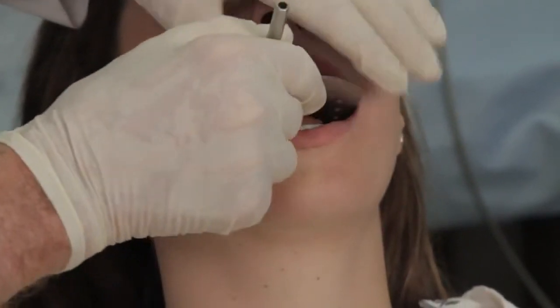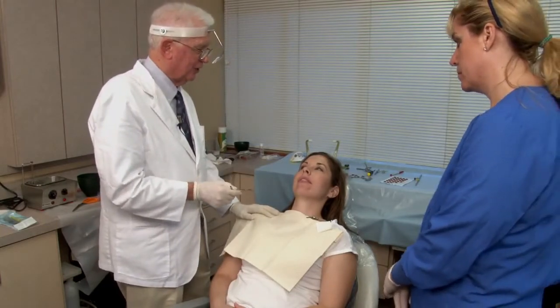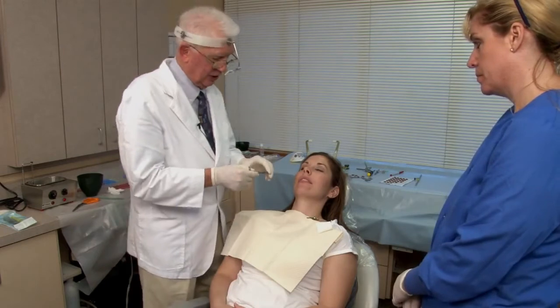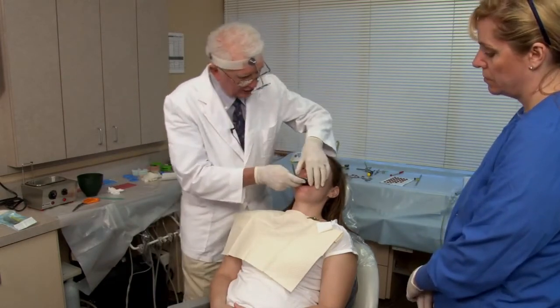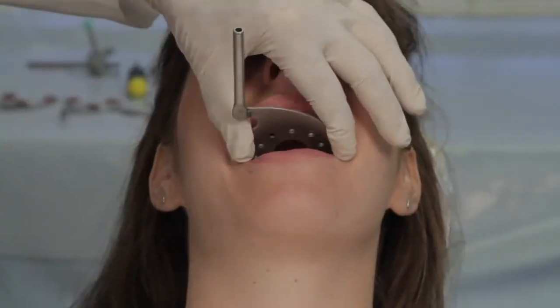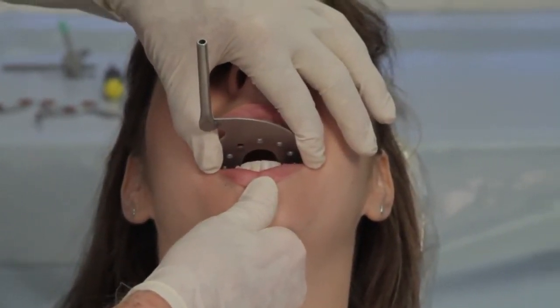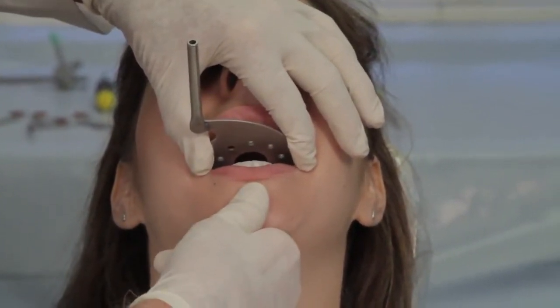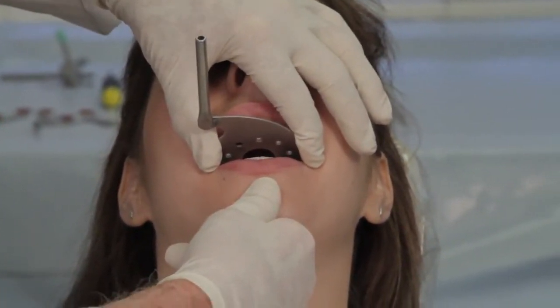We don't want to touch the bite fork. It's important not to touch the bite fork. So we'll close very slowly, and I'll stop you. And I want to see now how much wax and where to place it. Okay, close, very slowly, stop, right there. So you can see in the anterior segment how much wax I've got to place here to hold so that she closes into it at that vertical dimension.